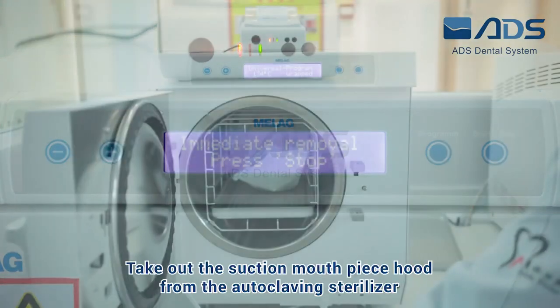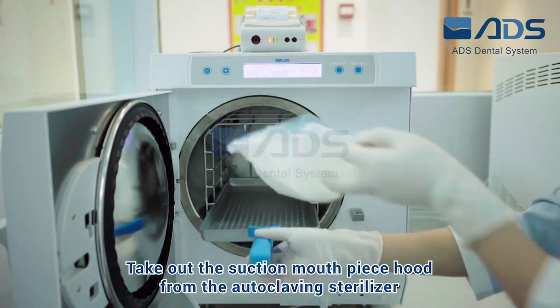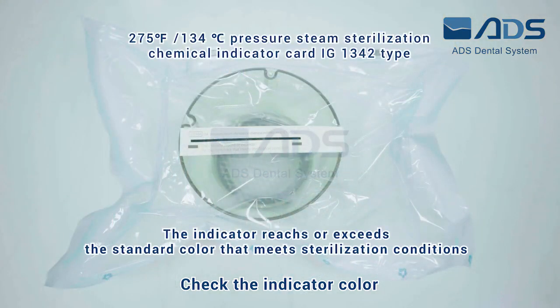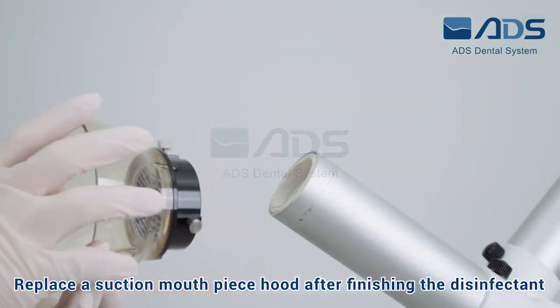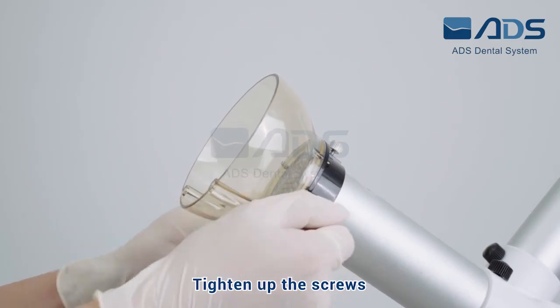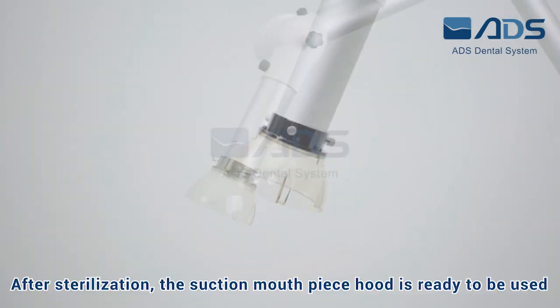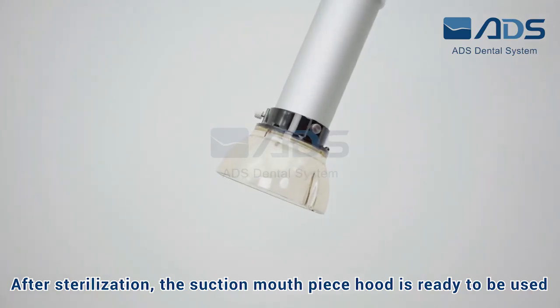Take out the suction mouthpiece hood from the autoclaving sterilizer. Check the indicator color. Replace the suction mouthpiece hood after finishing the disinfectant process and tighten up the screws. After sterilization, the suction mouthpiece hood is ready to be used.